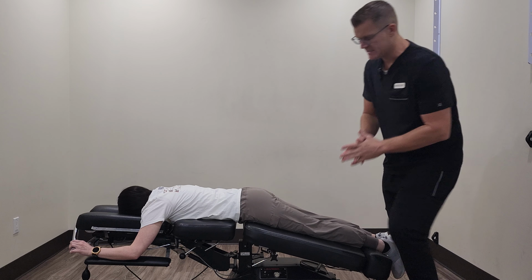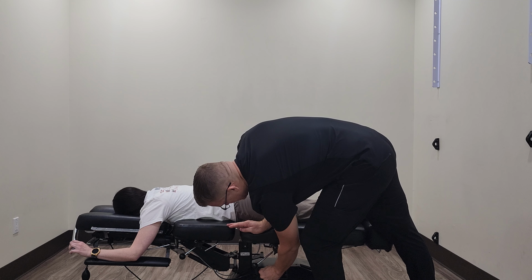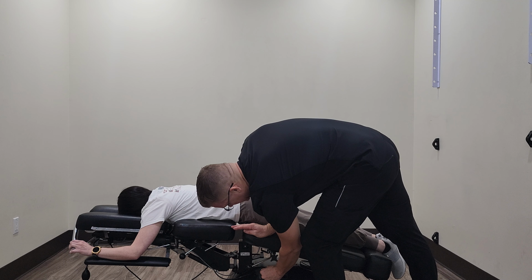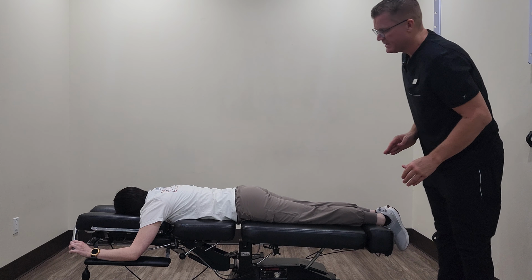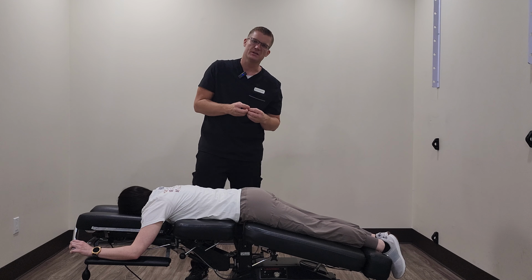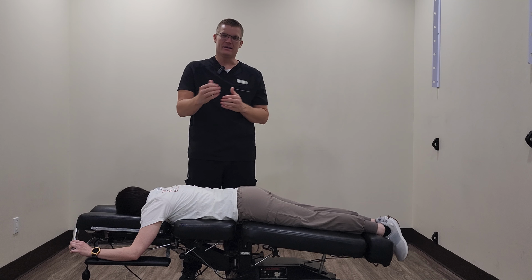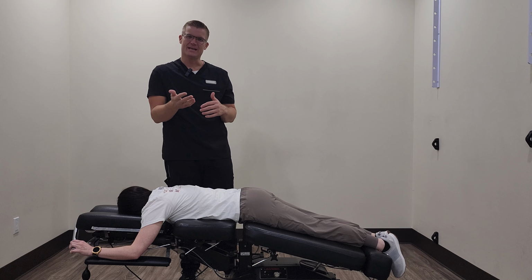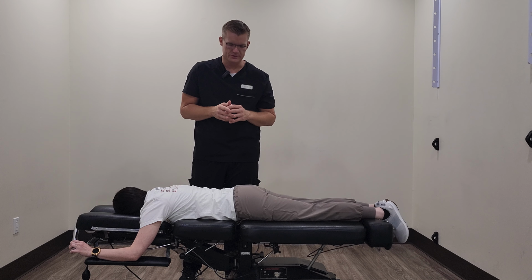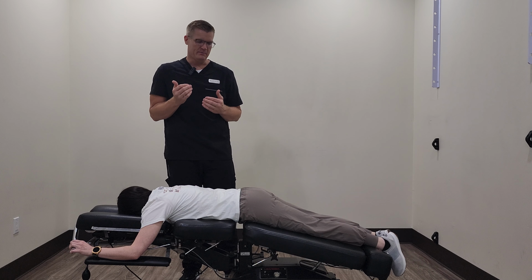Now I am going to slow this down a little bit to more of a traditional speed of a regular patient. So let's say you just came in and we determined that you have some discogenic pain, or pain that's associated with a disc injury. And you can barely move. You can't get on a table very well and you can't rotate side to side and tolerate a traditional adjustment. This would be something more along the lines that you would probably see.